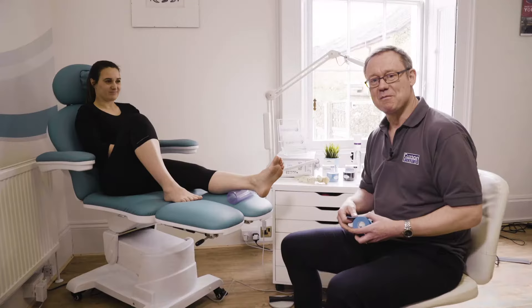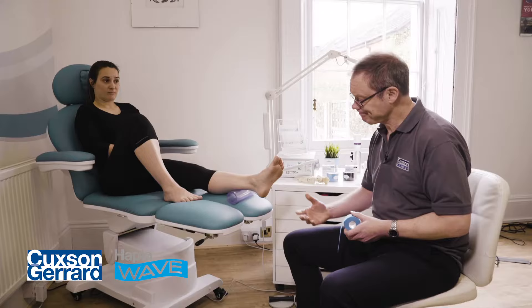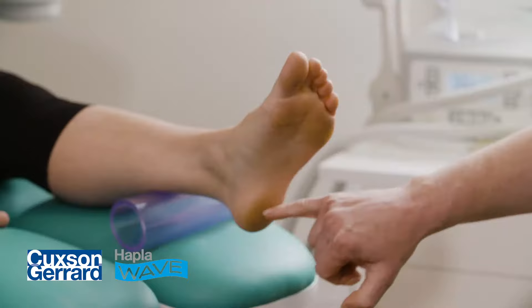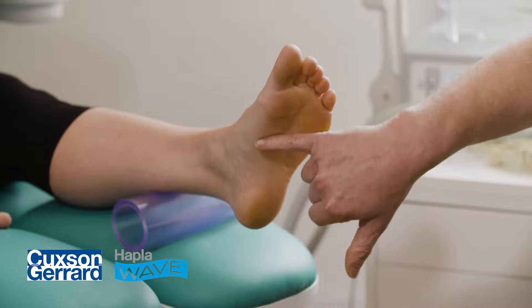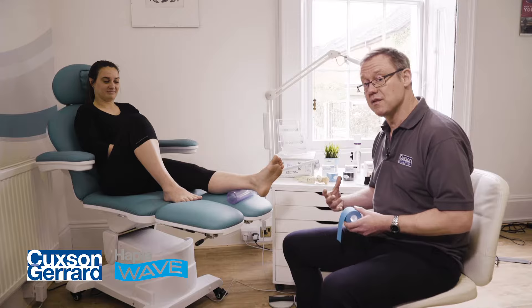Hello. Today we're going to look at the application of the Hapla Wave elastic muscle care tape to the plantar aspect of the foot to provide some acute relief to the pain that arises from a plantar fascial tractional pain — plantar fasciitis, if you like. Generally centering around this area here towards the plantar aspect of the heel and along the medial aspect of the plantar fascia, that medial band. We're going to apply some tape to give this acute relief.